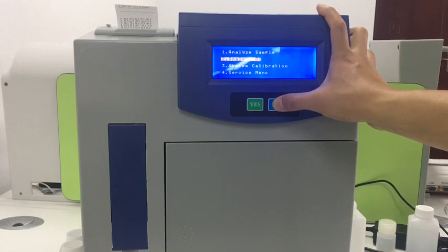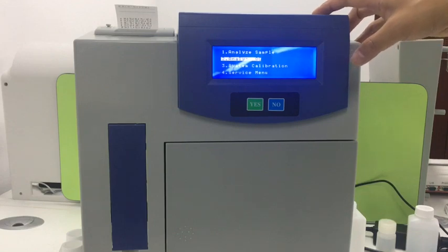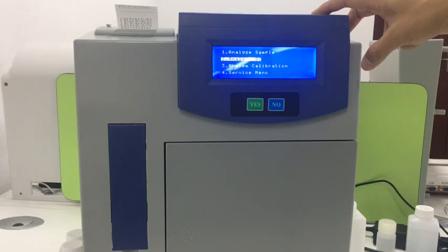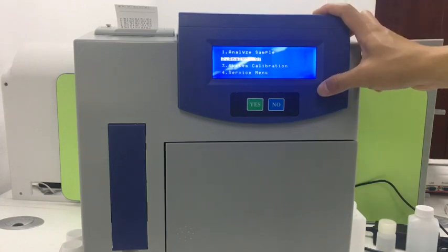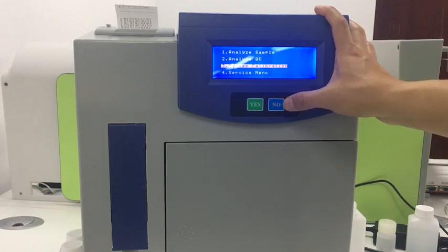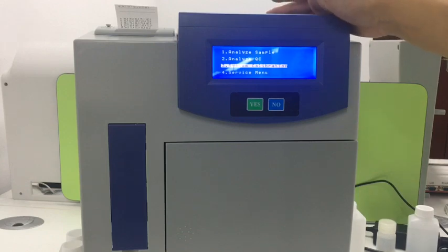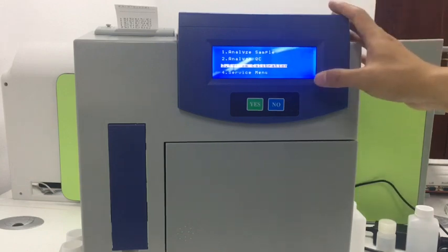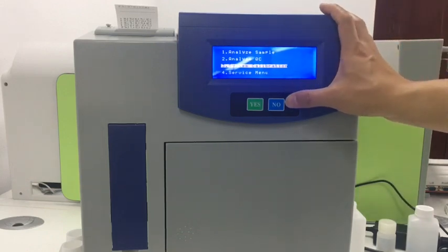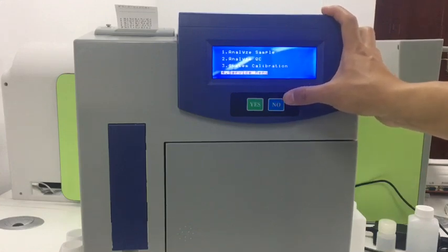Press No to see the next option: Analyze QC. When the end user feels the machine results are not correct, we use the QC solution to check it. The third option is service calibration — when the result is not stable or not right, we do the calibration first to make the baseline correct. If you need other services, go to the fourth menu.